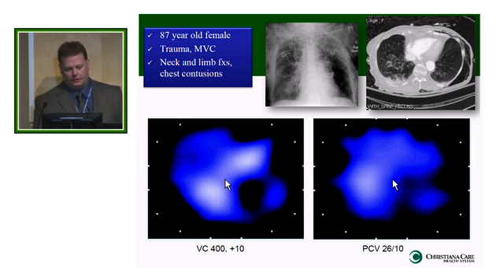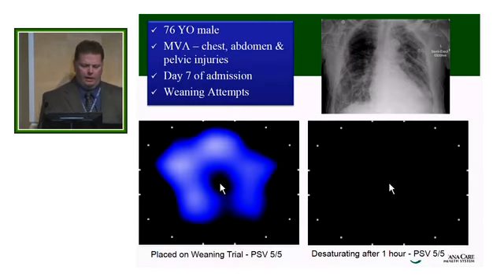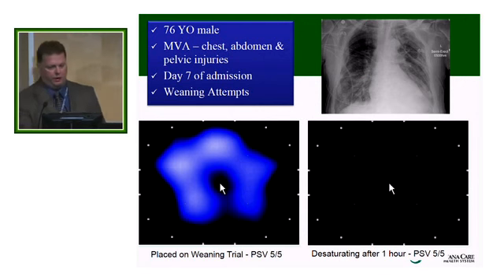And I don't know if you can focus here. This area here is very sluggish to inflate. And over here on pressure control, really the same PEEP, it is inflating better. And also we get better inflation in this region than we have over here as well. So what we saw in this case was better gas distribution. We were able to identify better gas distribution with pressure control versus volume control. And this was one really kind of cool case that we caught.